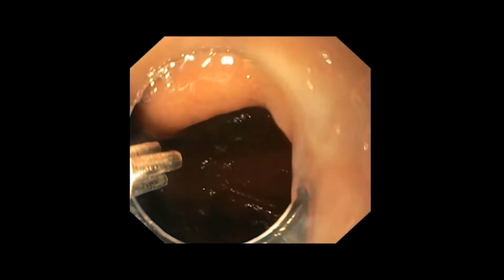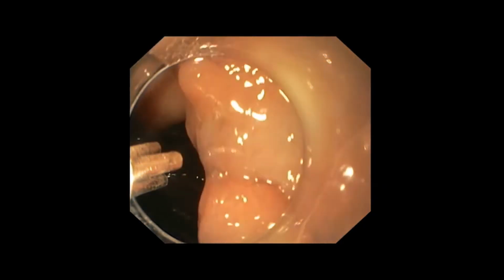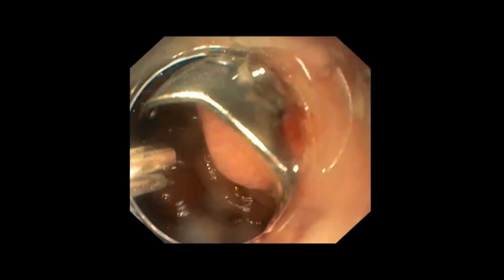The endoscopic image shows the OTSC that is subsequently to be melted using the remove DC cutter with repeated application of a bipolar electrical impulse.